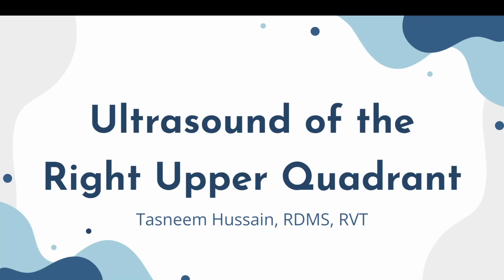So, welcome everyone to this ultrasound hands-on session. Before we start today, the first topic is ultrasound of the right upper quadrant.